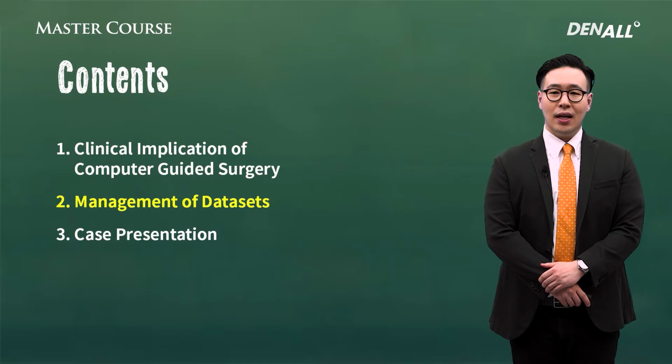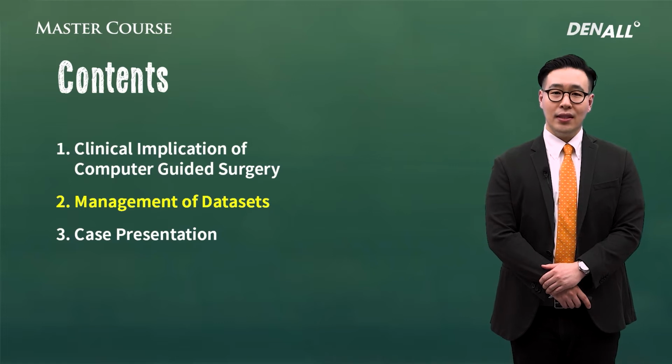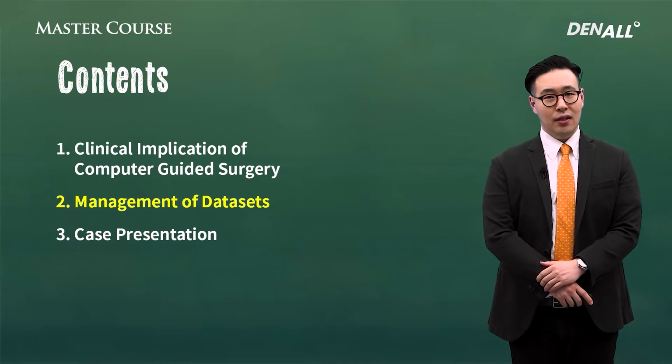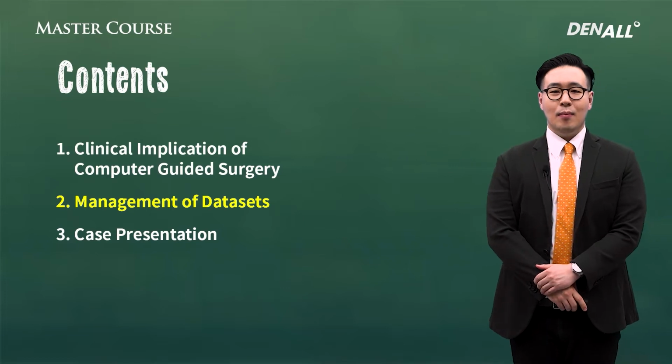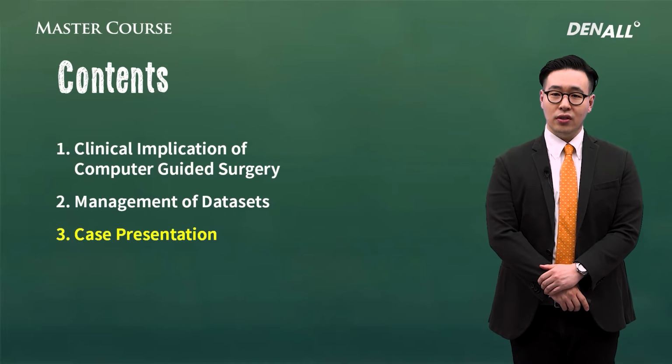Next, if the guide template is not accurate, sometimes errors can occur. Therefore, a guided template that can be used safely is the most important thing. Then, CBCT data and the surface scan of a patient should be merged together properly. Today, we are going to look at how to manage the data set. Lastly, what would be the proper indications at the basic level? And let's look at what the big benefits are that it can bring.